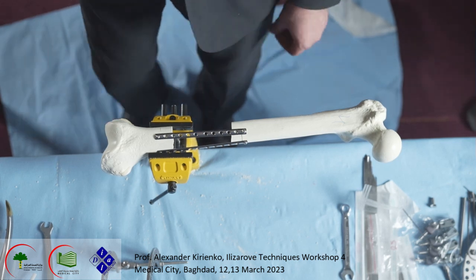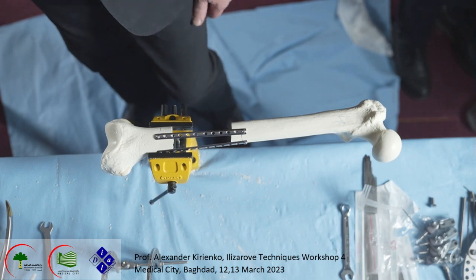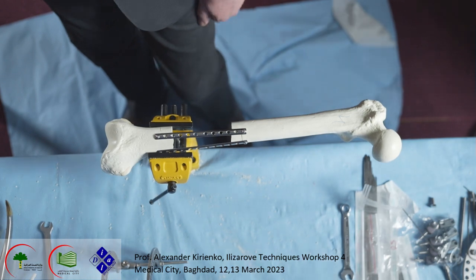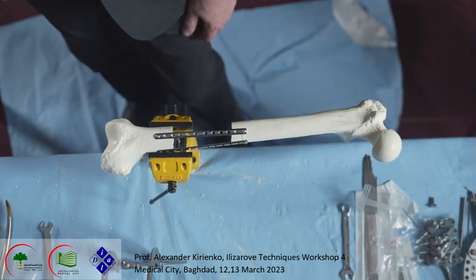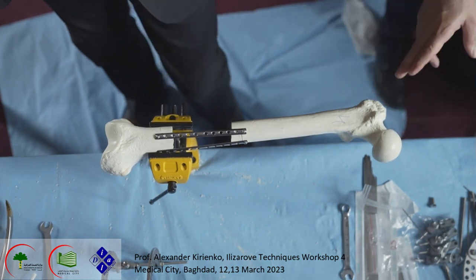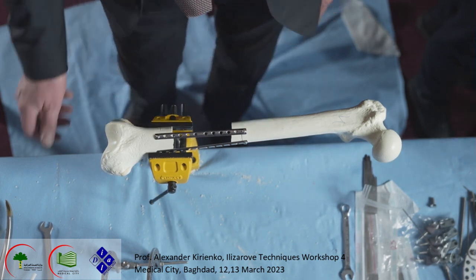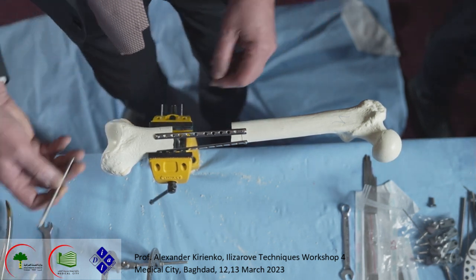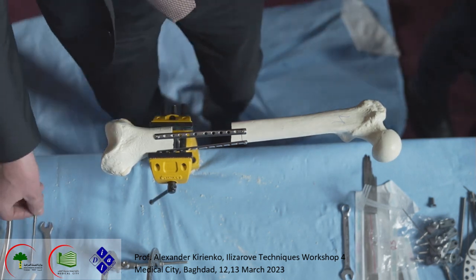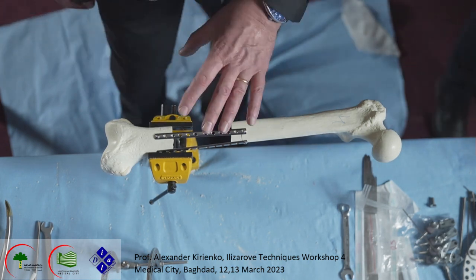Another workshop. It is a workshop about the treatment of the defect of the femur. We did the tibia defect, and now with a similar frame, we should do treatment of defect of the femur. You see this big defect here. It's practically 10 centimeters, quite 9 centimeters of defect. Not an easy case, and we should do it. Good job.